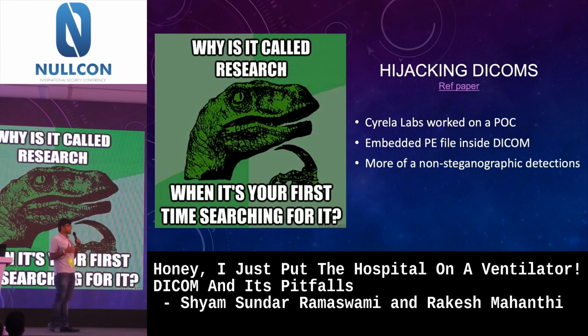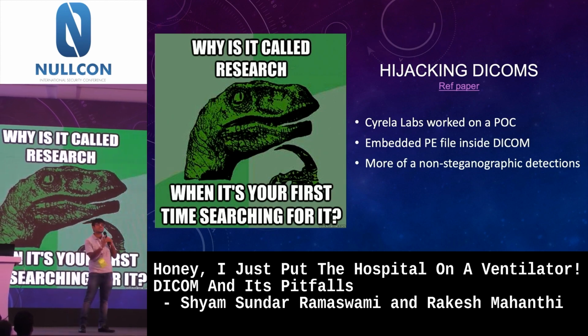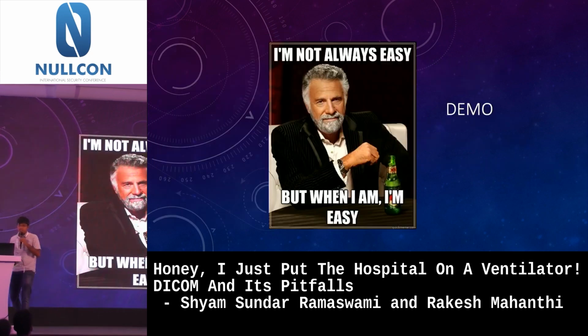So what I did was, I tried to write a Python script from scratch, which takes in a malicious exe and a legitimate DICOM, and produces a malicious DICOM, a file which acts both like a legitimate DICOM as well as a malicious exe. So let's move on to the demo quickly.